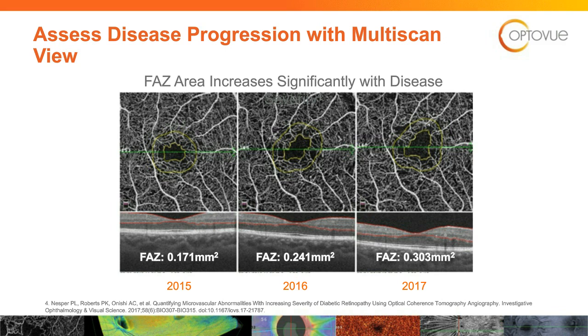But if they have an abnormal OCT angiogram, the literature is supporting now that that is a subclinical diabetic retinopathy, and you need to consider, will you now code them mild diabetic retinopathy?